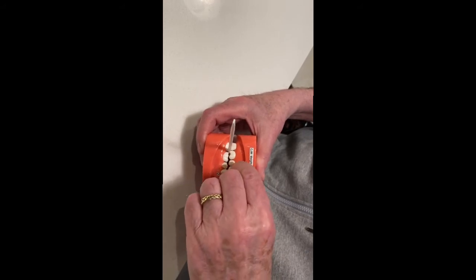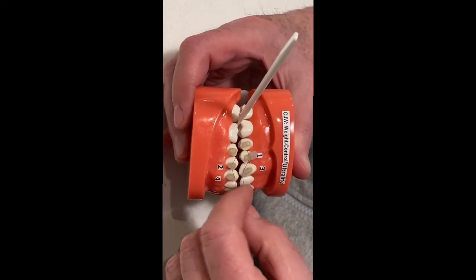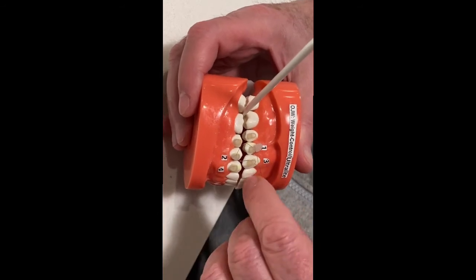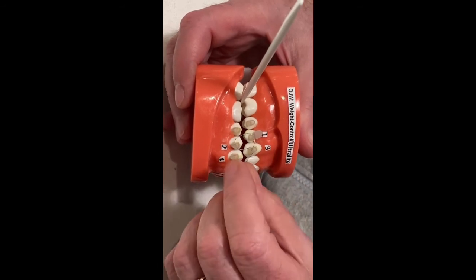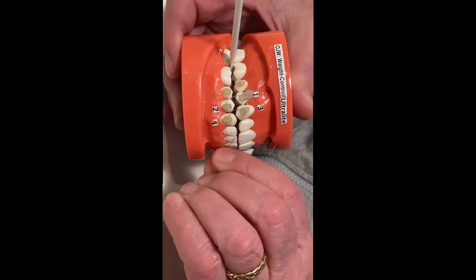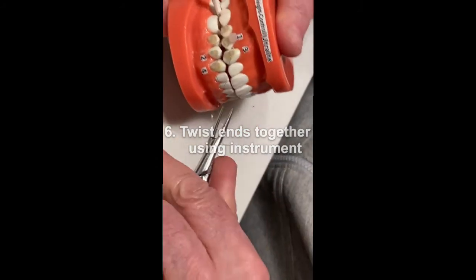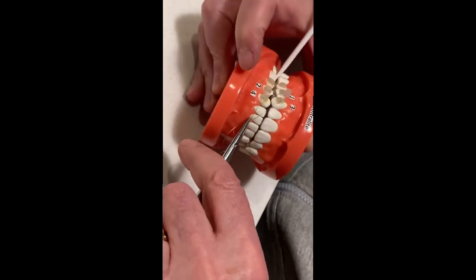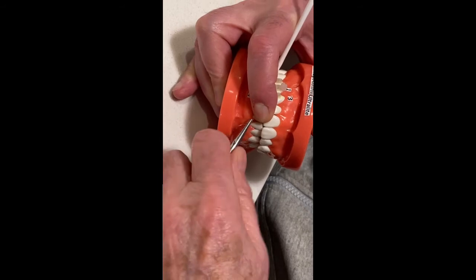Then, take the bottom part of the wire. Put it under bracket number two. Then, put it into the slot of number three. Then, take the top part of the wire and simply bring it around and join under four. Now, you bring the ends together. You take your twisting instrument and you start bringing it together. You can take your finger — this will help you so that you can twist the ends and take up the extra slack.